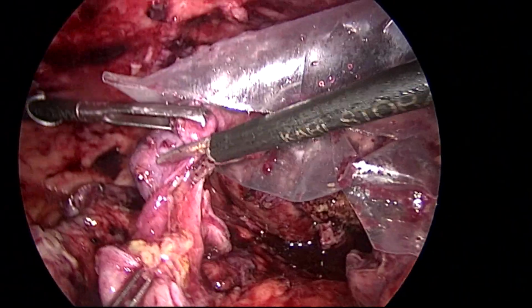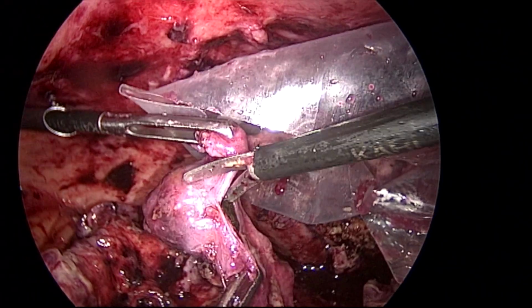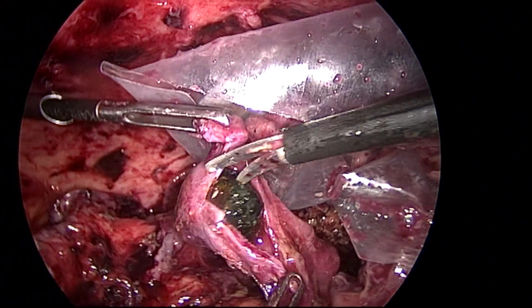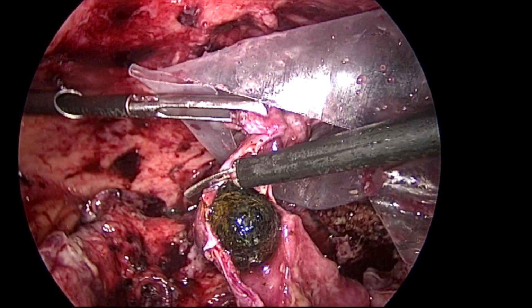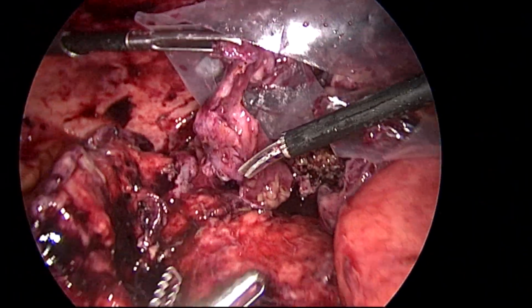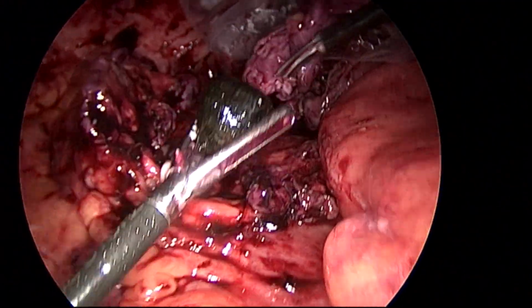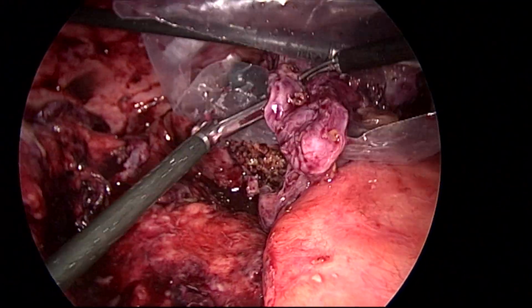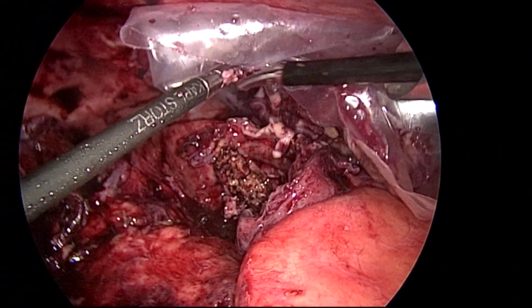So that made the infundibulum stone. See, that is a stone in the infundibulum. So this is the reason for cystic duct obstruction, and then initially lymphatic flow, then venous flow, then arterial flow will be obstructed. So the gallbladder becomes distended and edematous, and then becomes gangrenous, then empyema. So everything is placed in the endo bag.